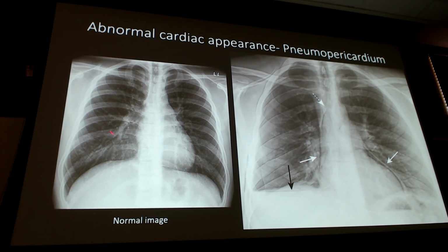Take a look at the normal first. I have the heart leading right into lung tissue. If I were to ask you on this normal image, show me where the pericardium is, you can't pull that out. You have no idea where the heart ends and where the pericardium begins, because it's all just one grayish kind of blob of organ and blood and tissue.